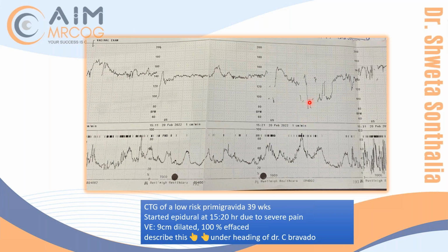So be careful about that. Otherwise, the CTG is beautiful, baby is doing good. There is acceleration, variability, everything is good. Contraction, if you see here to here, not 6, maybe I will say if this one, definitely not a contraction.